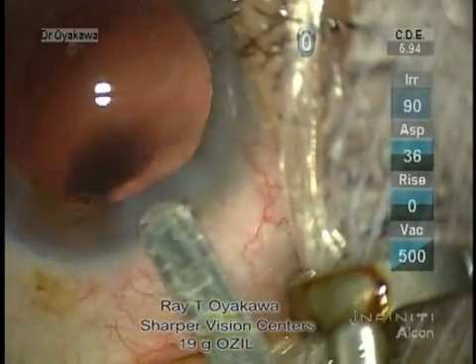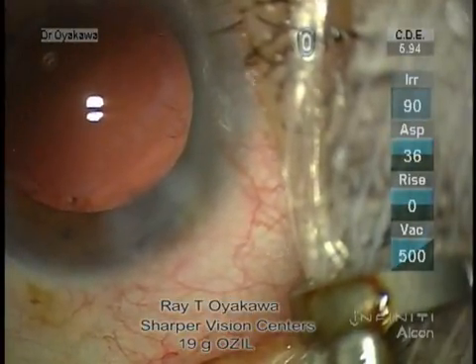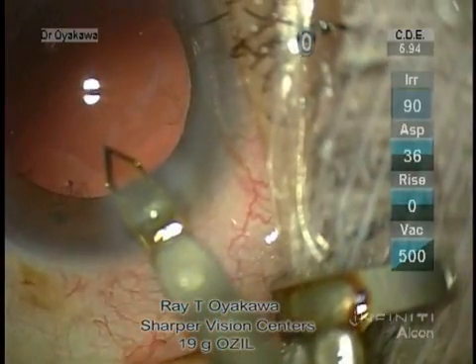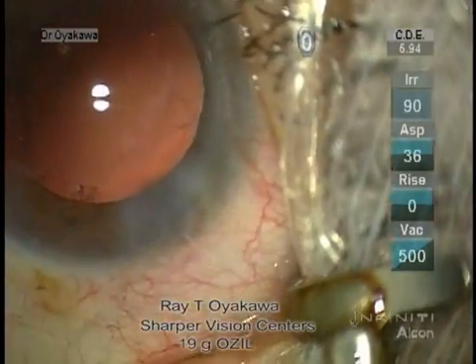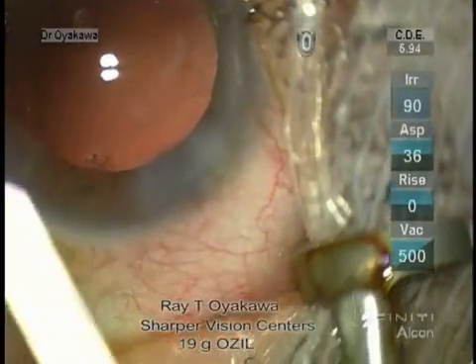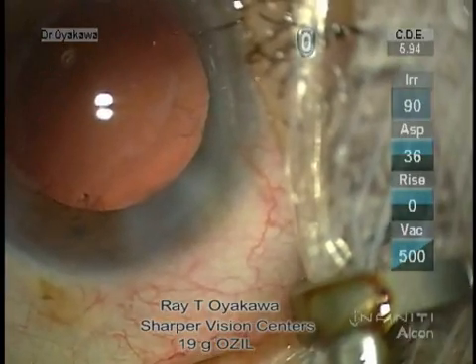The rest of the lenses are between 18 and 23 diopters. This is right after the bimanual incision. The wound size should be around 1.7 or so. A diamond blade is used to just slightly enlarge the wound, bringing it to just about 1.9.